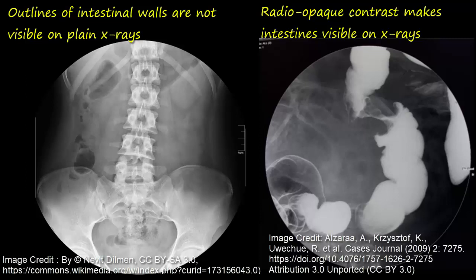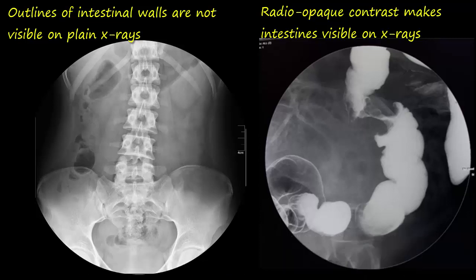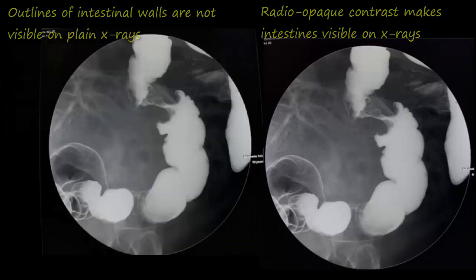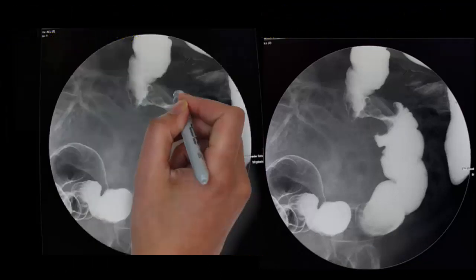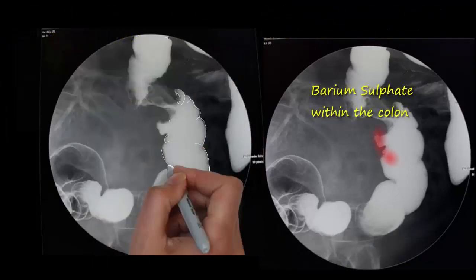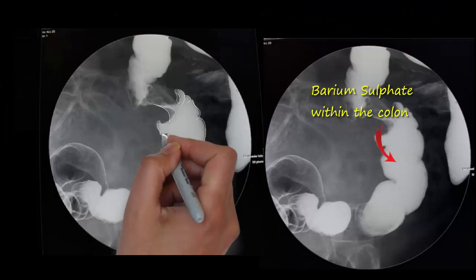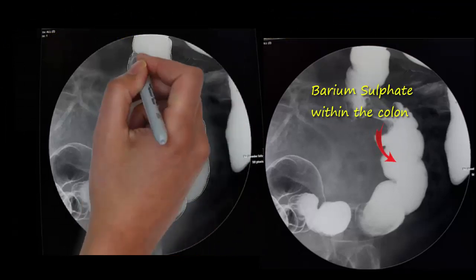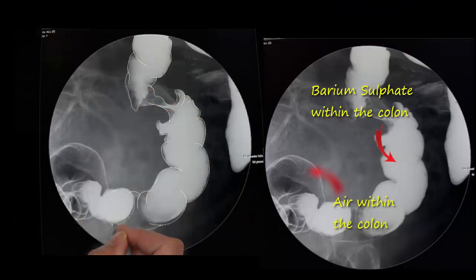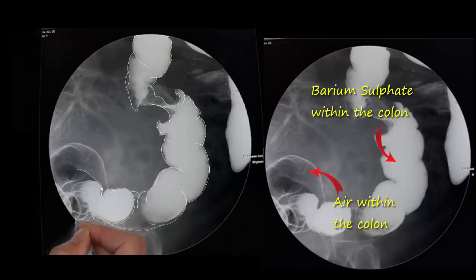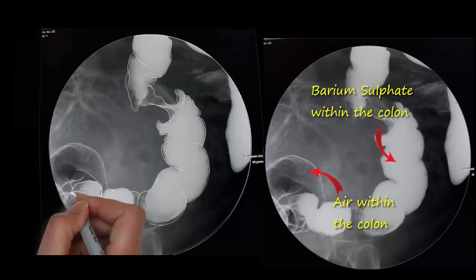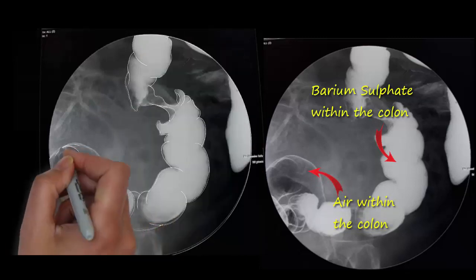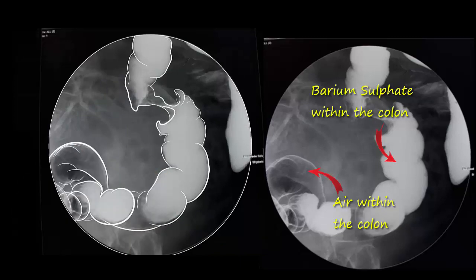When barium sulfate is pushed into the colon, the coating results in a relatively clear silhouette of the colon on x-rays, as visible on the image. To produce even higher quality images, air is also introduced into the colon through the enema tube, which has the opposite density. Such radiographic studies are thus known as double contrast studies.